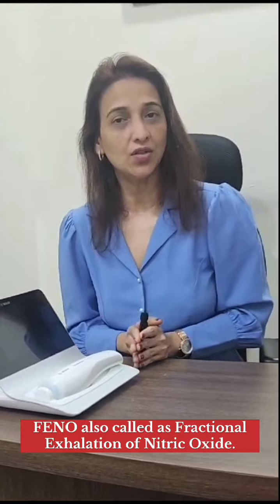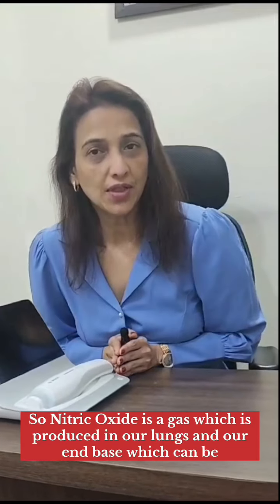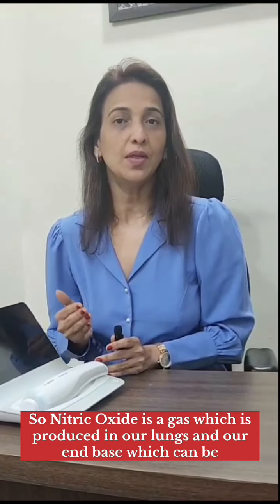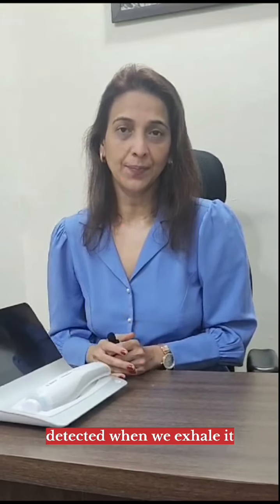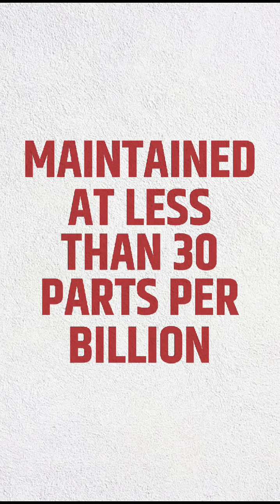Hello. So today we are talking about FENO. FENO is also called fractional exhalation of nitric oxide. Nitric oxide is a gas which is produced in our lungs and our airways, which can be detected when we exhale it. Normally the levels are maintained at less than 30 parts per billion.